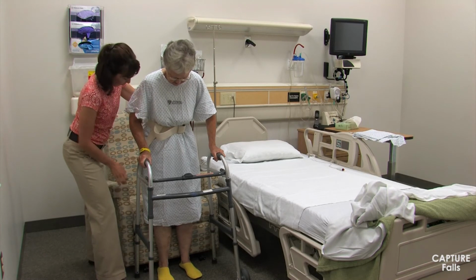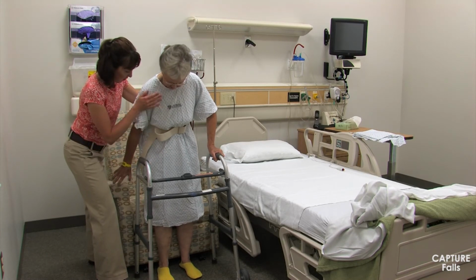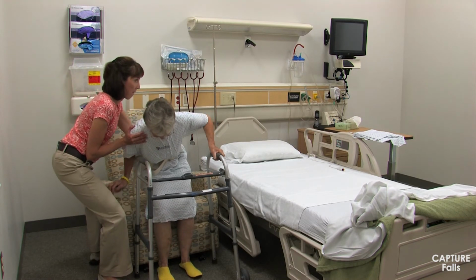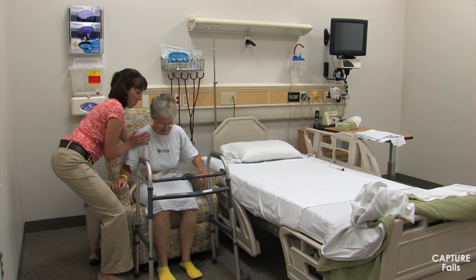When the patient feels the back of both her legs touching the chair, have her reach back with one or both hands for the armrest of the chair as she slowly lowers to the sitting position. As you help the patient lower into sitting, you can squat down with your legs as the patient descends to help keep your back in a good position.